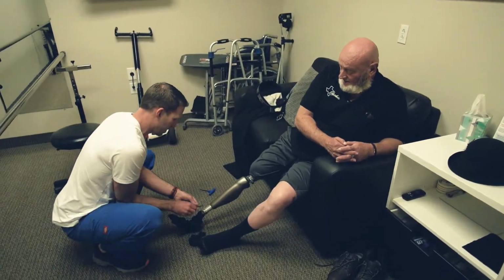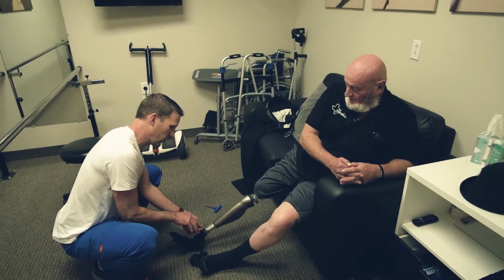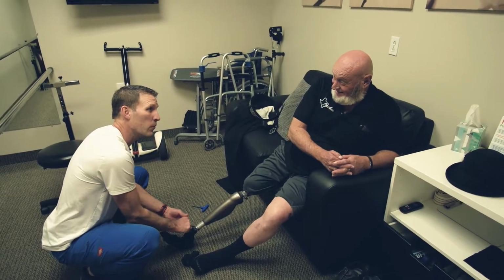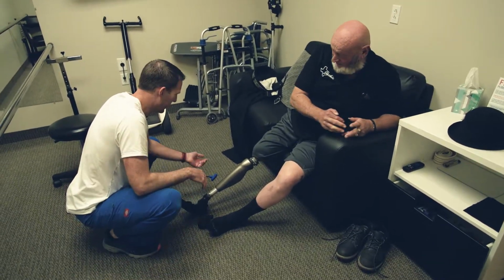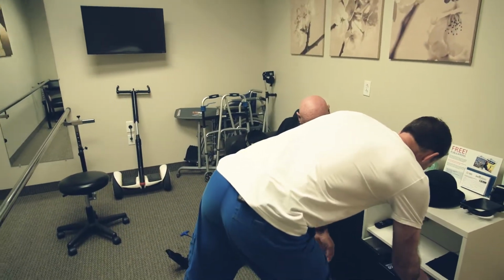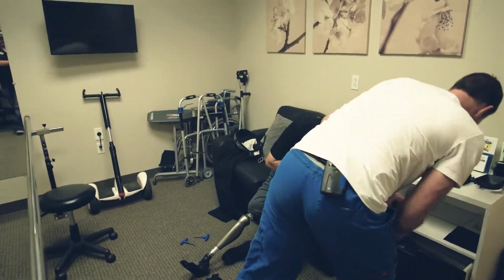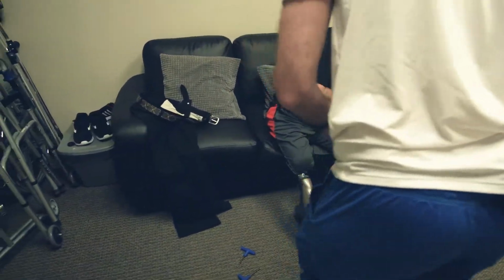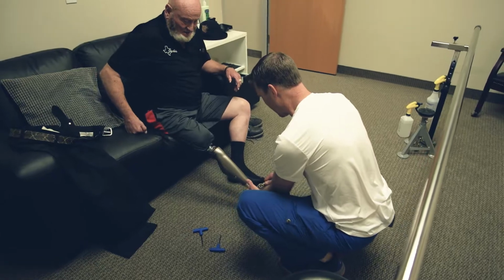So a new sock, and next I'm going to go see if I can find a used foot shell to get you by. There's no repairing those once they break. It looks like I tore that in all pieces. I really am glad you told me that you were digging holes in your shoe, because I would not have checked that. See, look. Yeah, it's the carbon fiber. It's amazing how fast it'll eat through stuff.